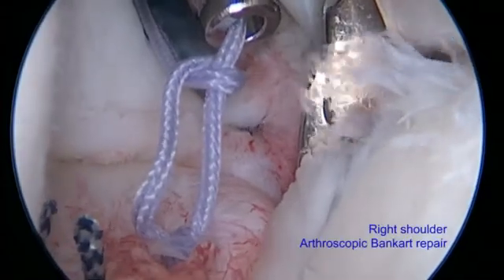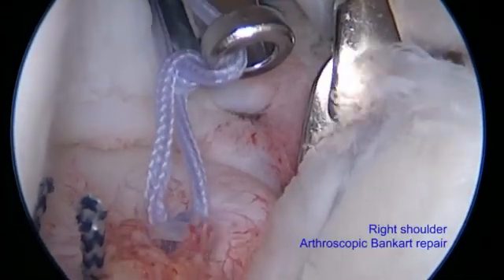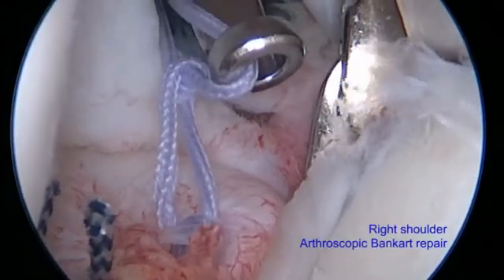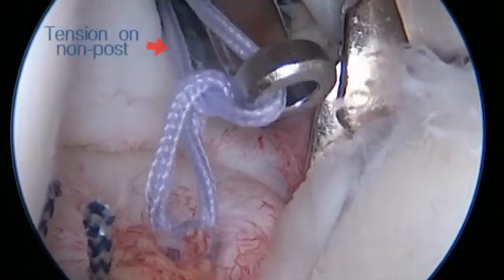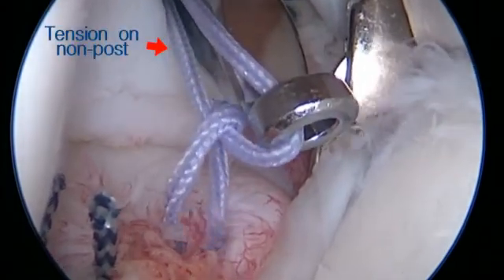Clip showing arthroscopic Bankart repair of the right shoulder using alternate half-hitch knot delivered sideways down with tension on the non-post or the orange limb.